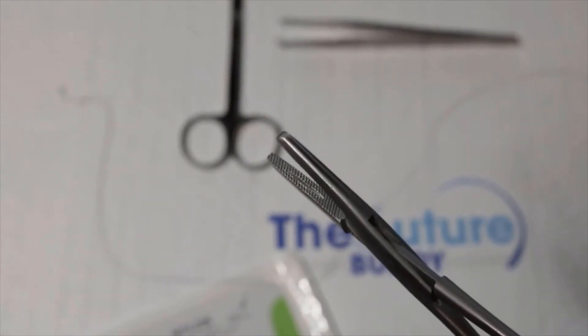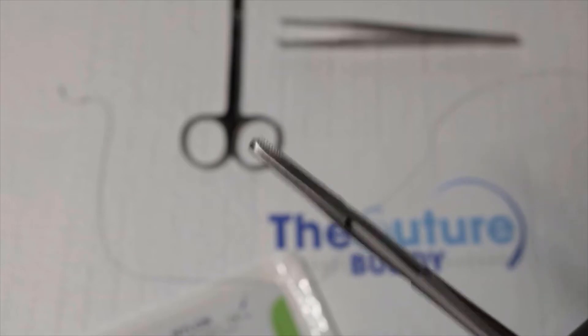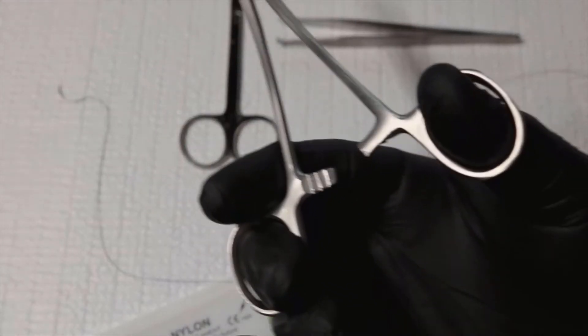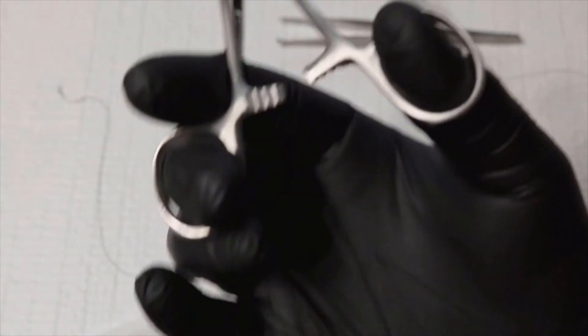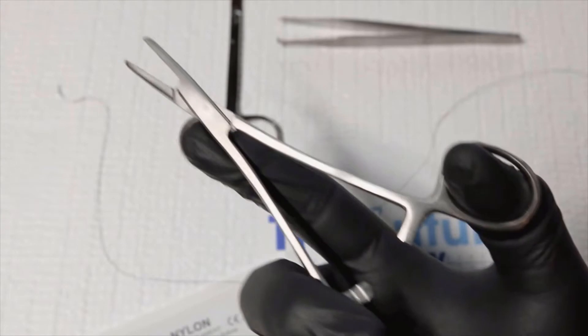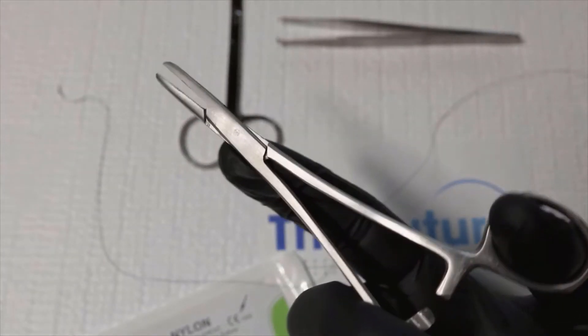You see the serrated teeth really help for grabbing the needle. I typically use my index finger for stabilization of the needle driver with rough or really dense tissue.